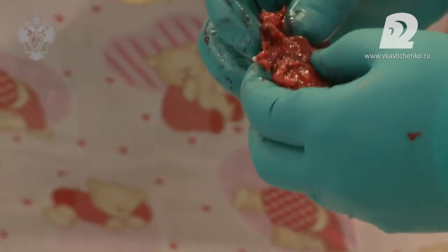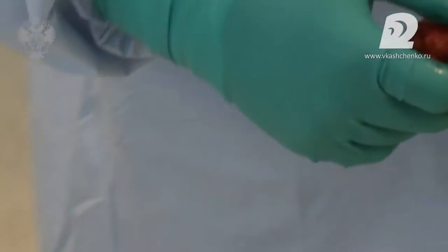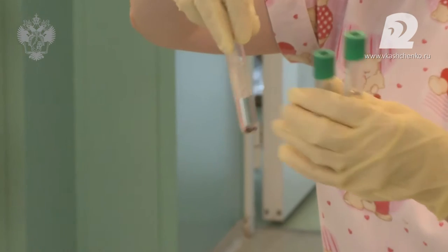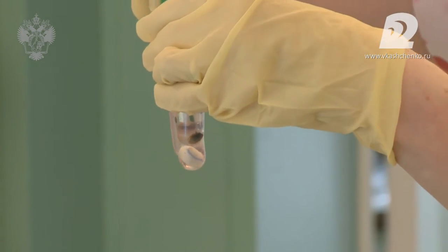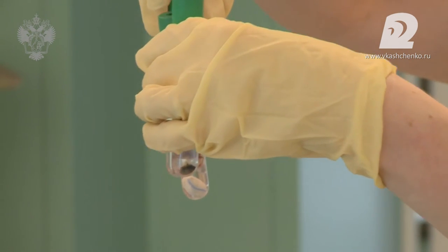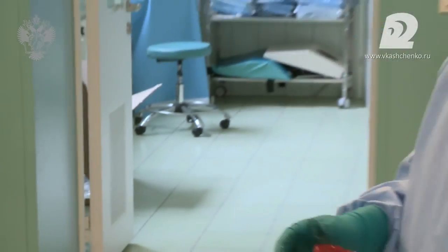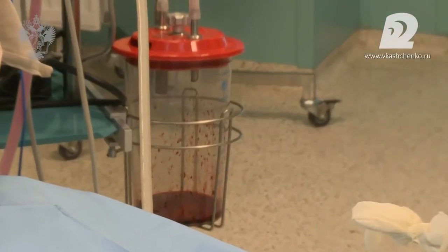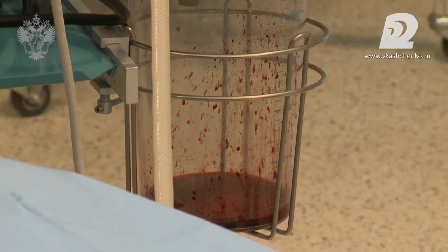Are there any separate lymph nodes which you removed separately? Yes, I marked them, labeled them. And you can demonstrate them to the camera. They have been marked and labeled. Look, and they are in tubes. These are the lymph nodes from the areas which are not adjacent to the specimen. And also, you can look at the blood loss volume. You can see how much blood the patient lost.